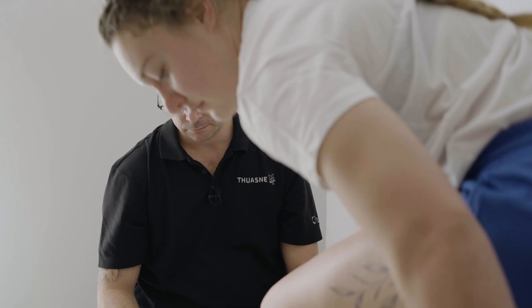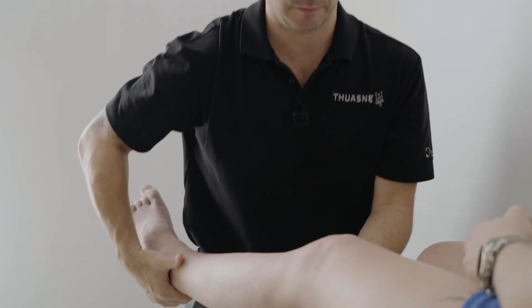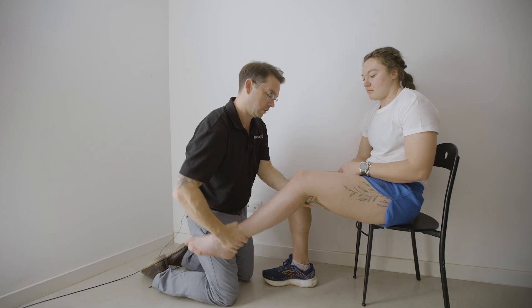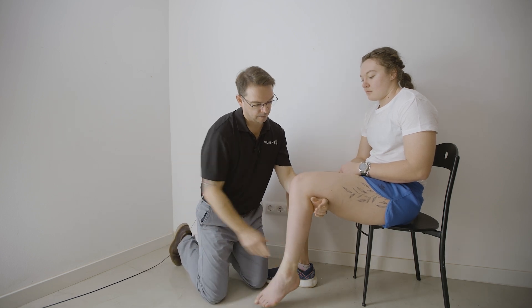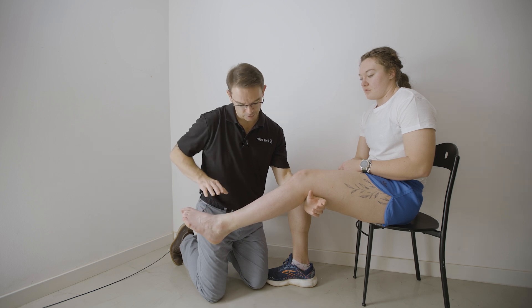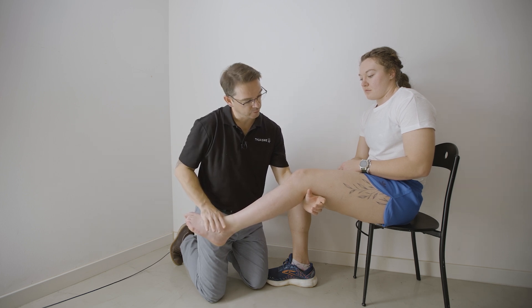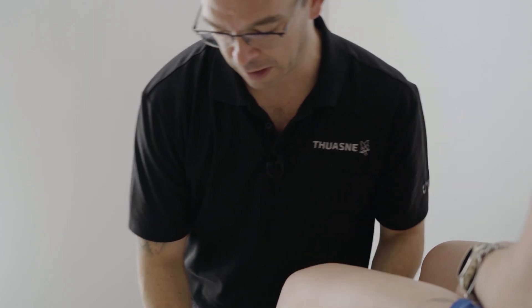Let me just check the rest. Checking your knee range — you've got full range of motion. Can you kick your leg up for me? All the way up — so we're slightly short of full range. I'm going to push down, resist me please. I would record that score on the back of the form. I would do the same for the other side as well so that I have a comparison, and record that on the other side too.